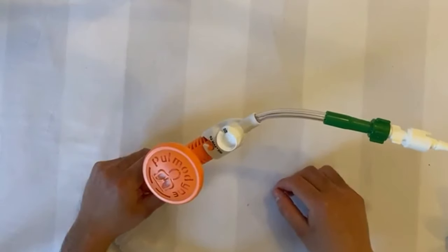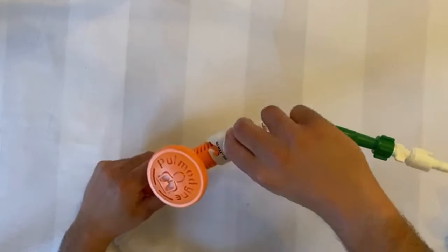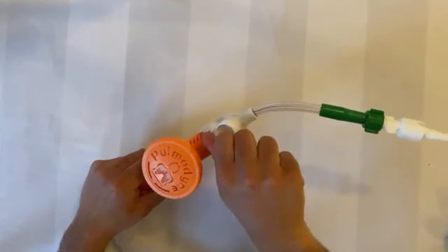Located just below the Schrader connector is the FiO2 dial, which can be turned to deliver 30, 60, or 90% oxygen.